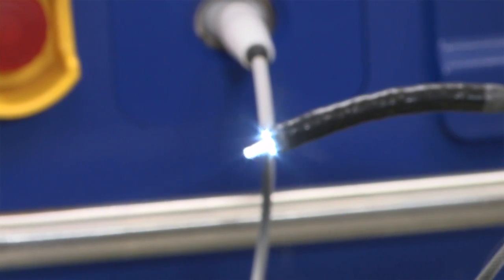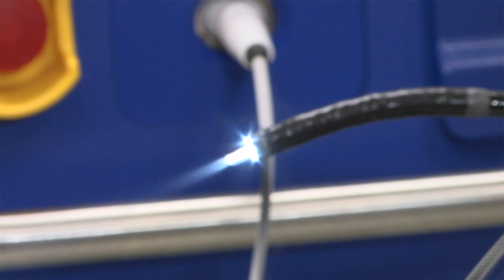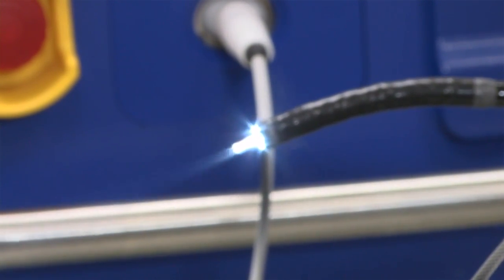This is sprayed on the targeted area of interest, typically for 20 seconds, with the timer beginning once we see complete freeze of the targeted tissues.